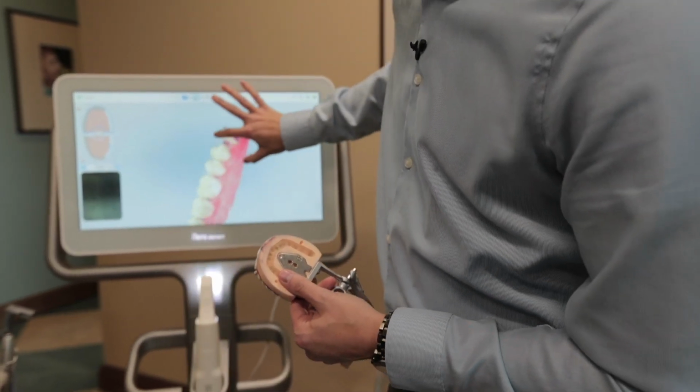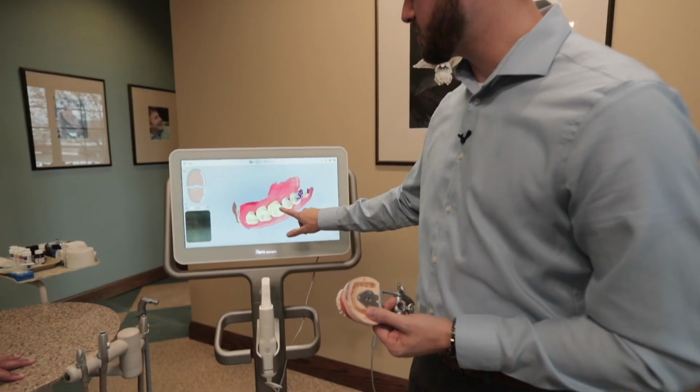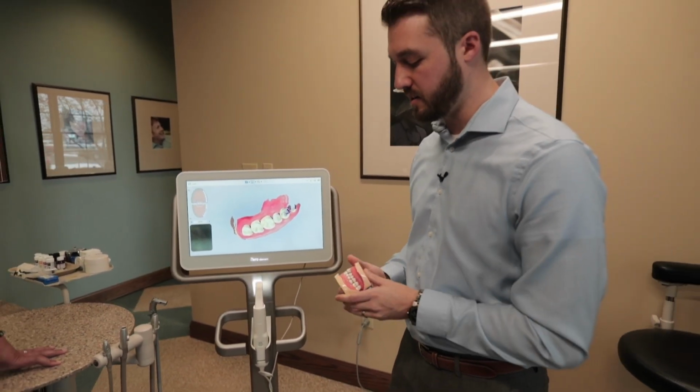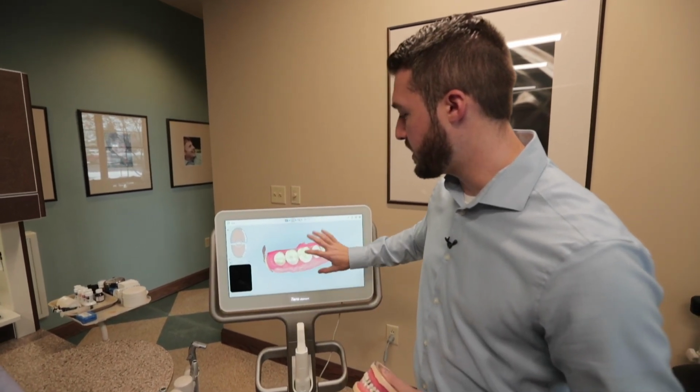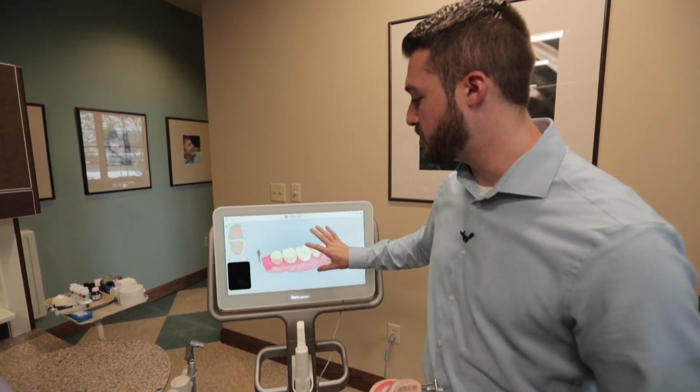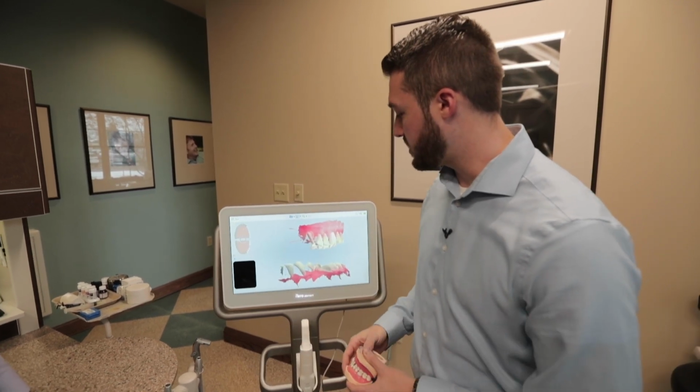All right, so we're just going to take a quick look at what we got. Looks pretty good right there. We don't need to worry about those interproximals because that's not going to affect the fit of the crown. What we see a lot of common issues with our scanner is people trying to overscan, spending too much time because they collect data that they don't necessarily need. We're then going to proceed to our bite.